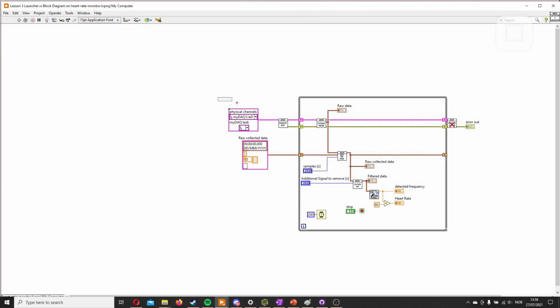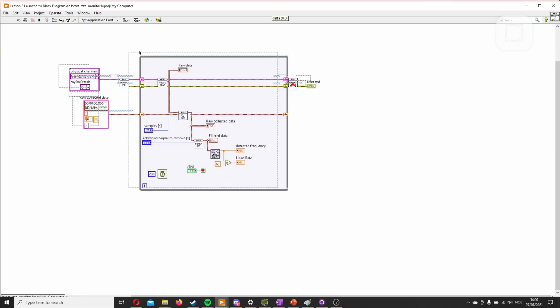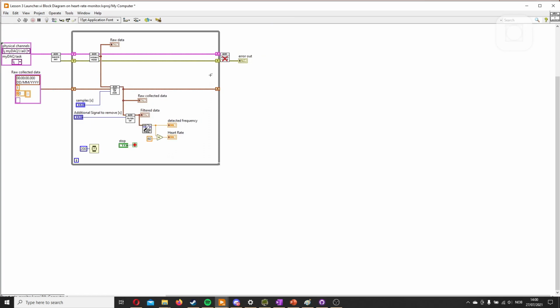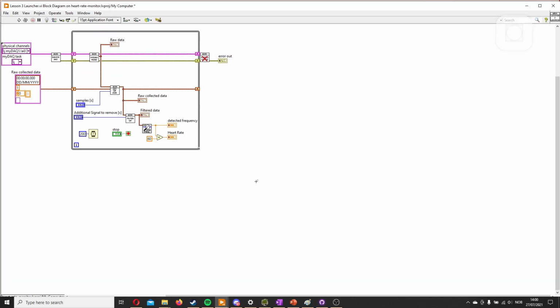The goal is really to separate this out to its own loop and set up communication between this and this, so they run in parallel. The first thing we could do is just to move this in this corner. And we can also shorten this one by Control Alt, there you go, and there. So we'll need 2 loops. And we'll start with a while loop because we want them running continuously, so we'll still use a while loop.